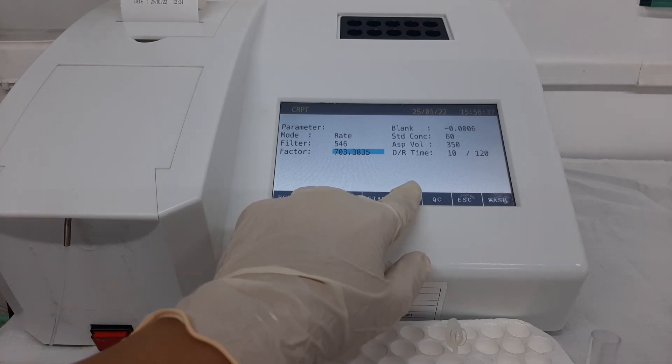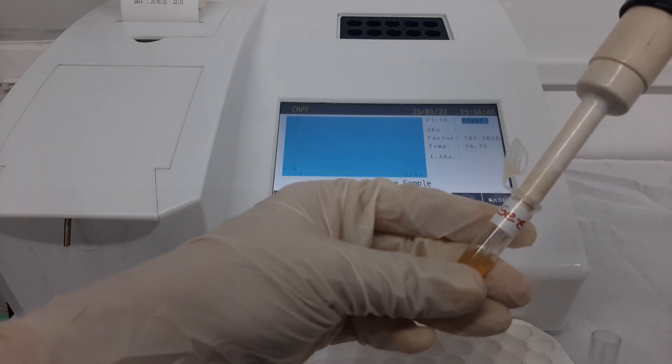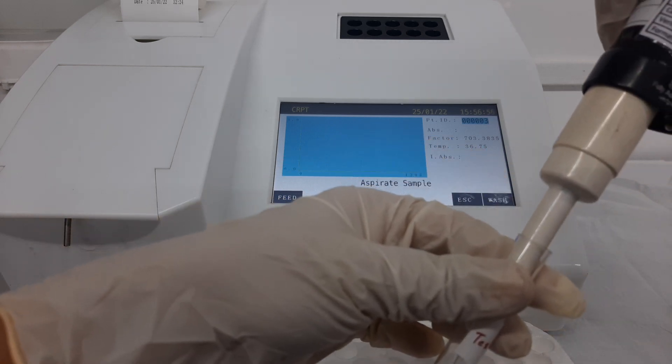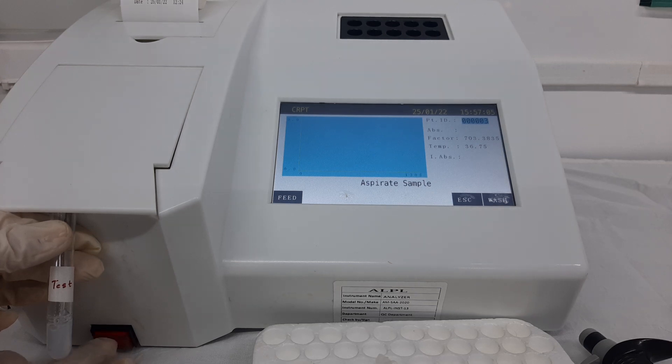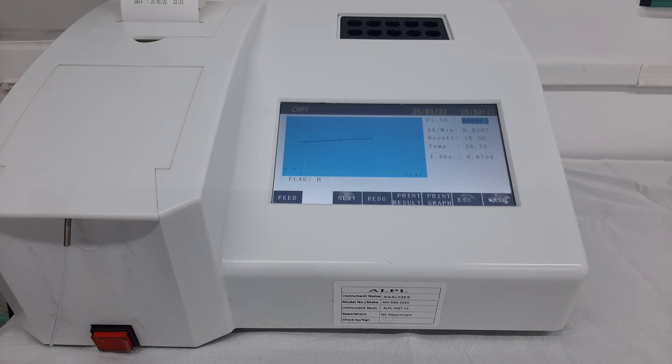Next, select the option of sample to run the patient sample. The software will ask to aspirate the sample tube. Take 5 microlitre of patient serum, rub the outside of the tip with tissue paper, and add the sample into the third tube labelled for test. Mix the components and select the aspirate button. A delay time of 10 seconds is initiated, followed automatically by a read time of 120 seconds. After the read time is complete, the instrument displays the delta absorbance per minute and the result, which is 15.06, indicating a high CRP value.